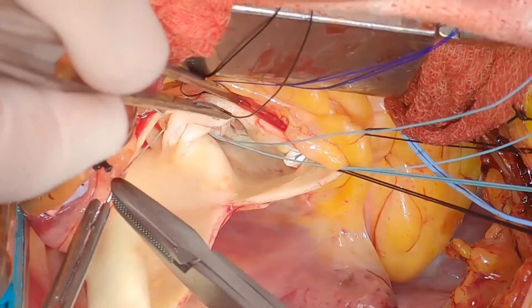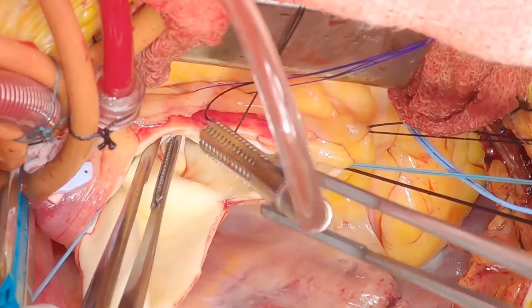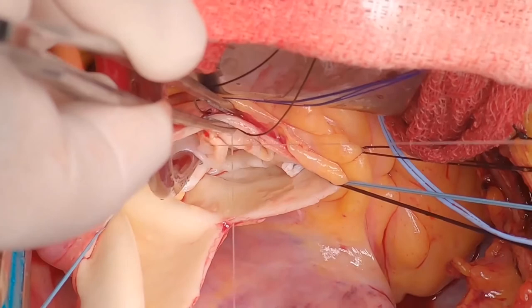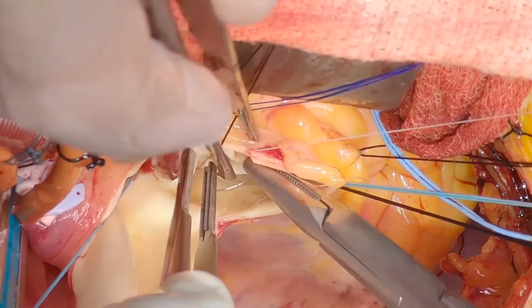With the valve on tension, the key throughout the process is to stretch those leaflets so you have an understanding of how much plication you need to do. Many years ago, we did a study at the Cleveland Clinic showing that plication has much better durability than resection and sewing other leaflets together. The problem is that leaflets can tear. Over many years of experimentation, I find this 5-O ethibond is the best suture for repairing incomplete fusions of the leaflets or prolapse — stick to the thick parts of the tissue.